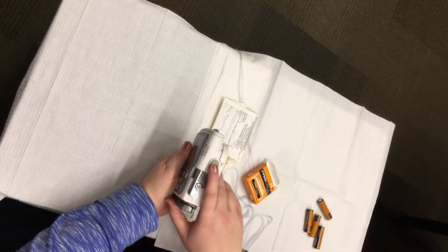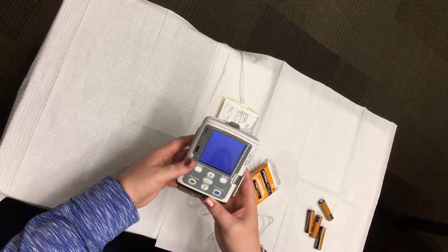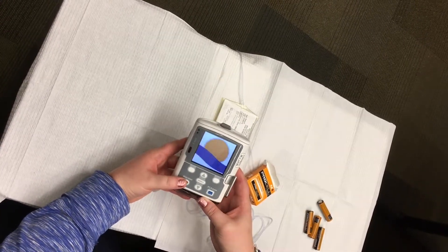Turn the pump on by pressing the power button on the right side of the pump. When the power process stops, press the start/stop button.